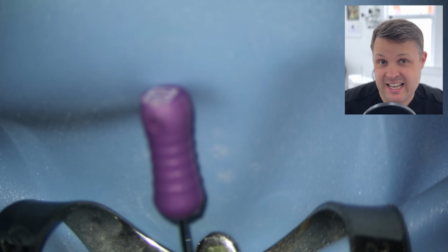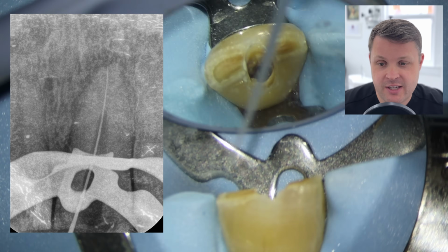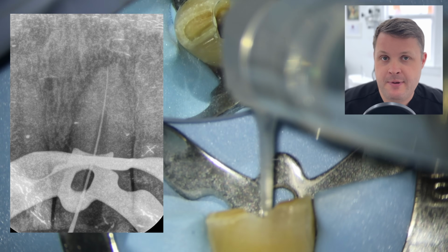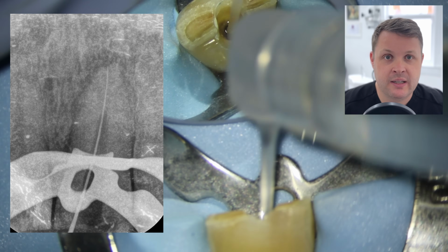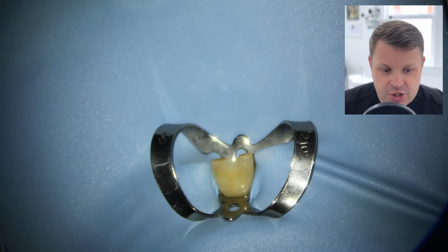And in this case, I don't usually do this, but I'm taking a working length x-ray, and we can see here now that we're at the correct length. So I'm happy that this is actually the genuine working length of this tooth. We're going to finally shape this tooth.